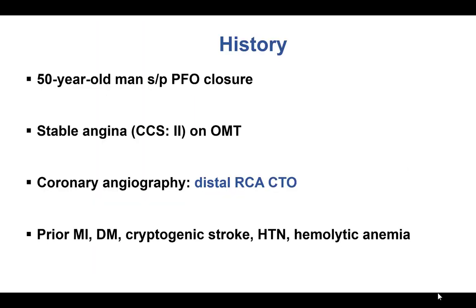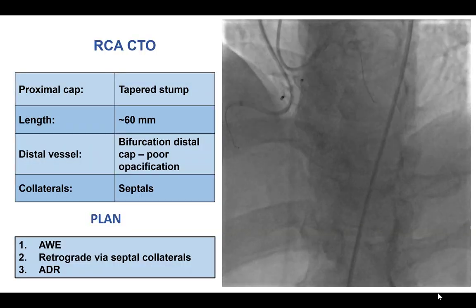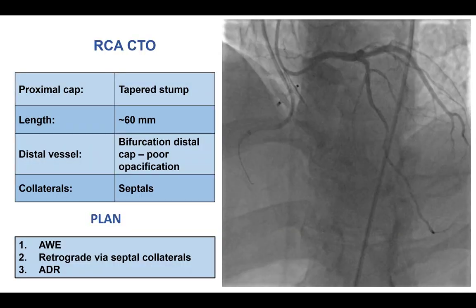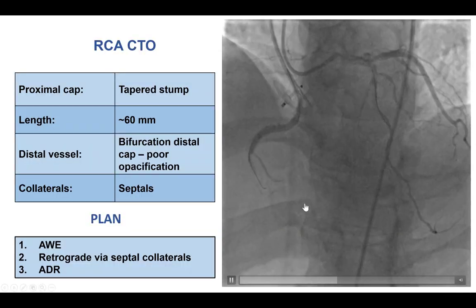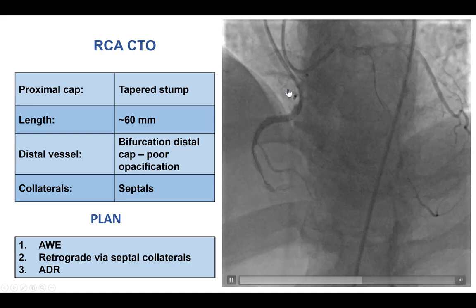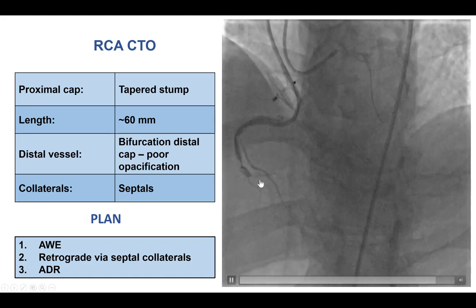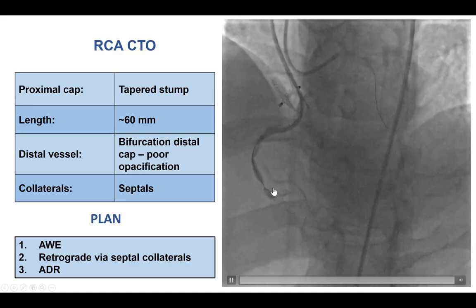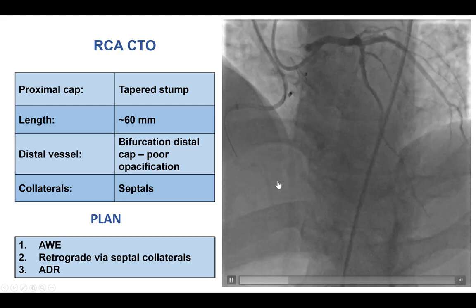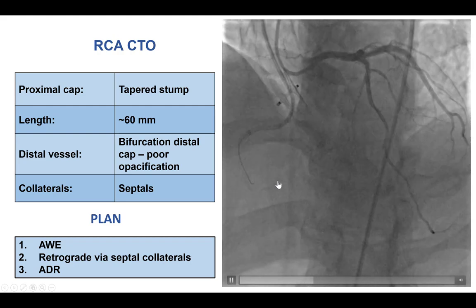The patient was a young man who presented with stable angina. He had a recent PFO closure and was found to have a distal right coronary artery chronic total occlusion. This is the PFO device. He did have a distal right coronary artery CTO with a tapered proximal cap.